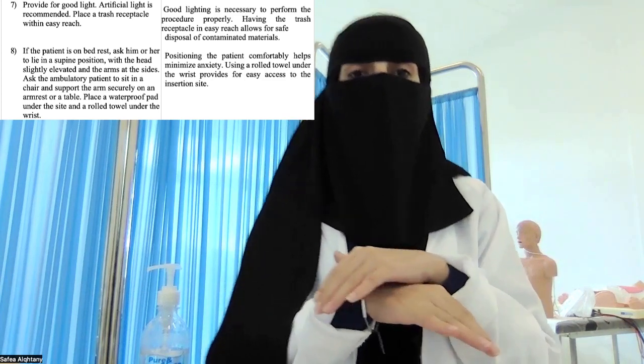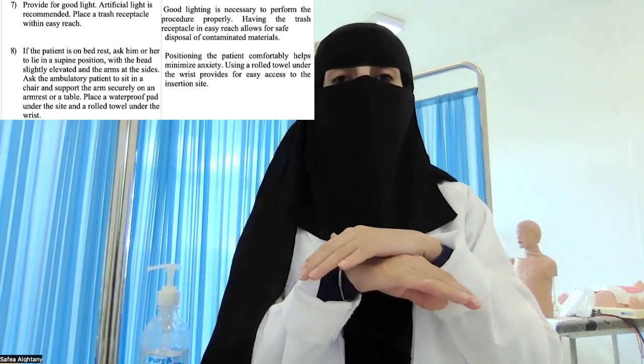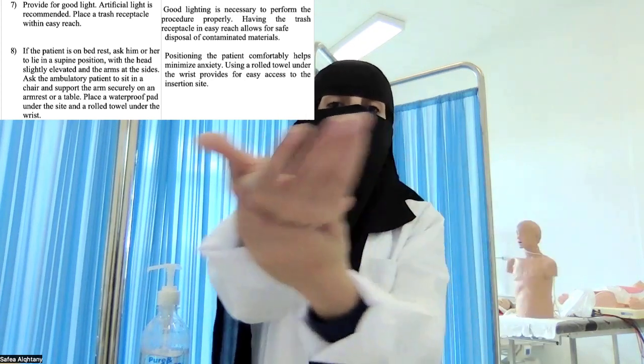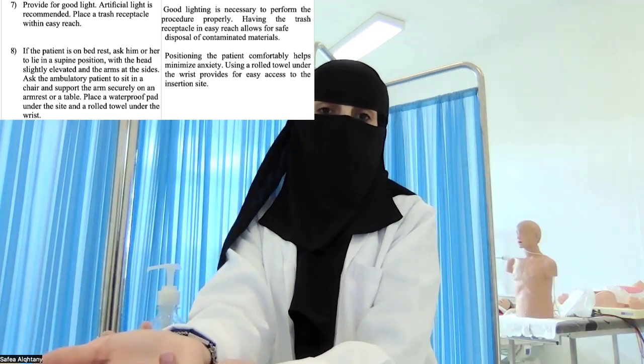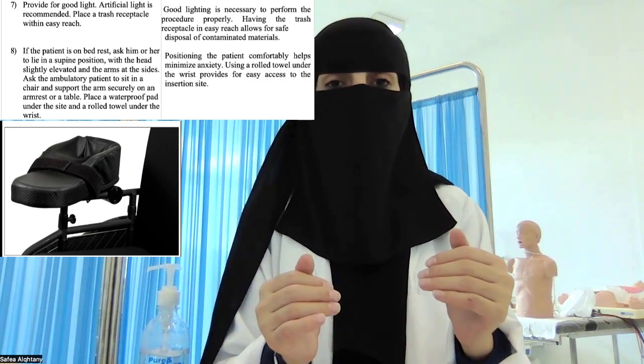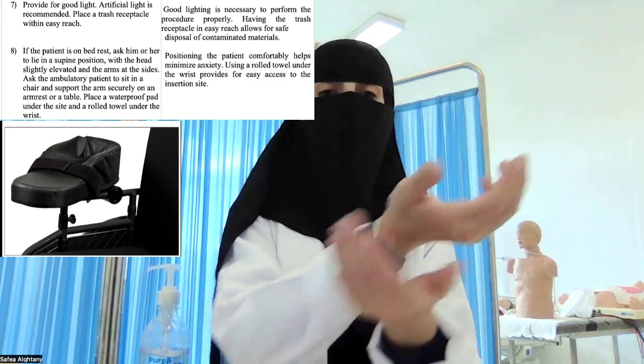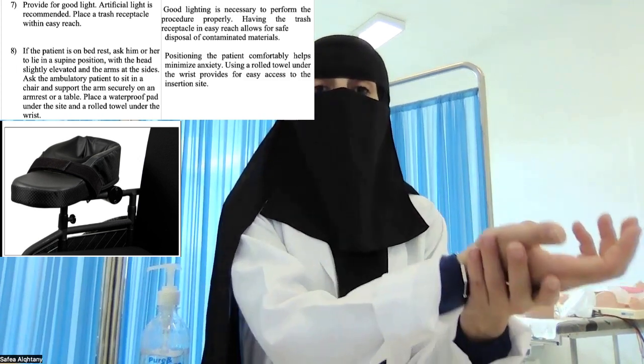طبعا لو كان البيشنت على bed rest، يعني patient is in bed rest يعني مستلقي على السرير، I can take his hand and put it at the side of the bed. If the patient is in sitting position, I need to place his hand at the side and support it with the arm sit or arm table.